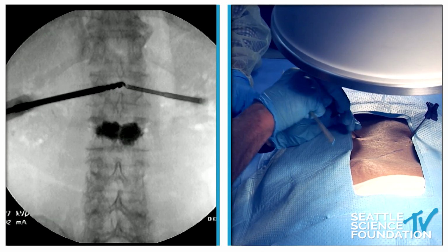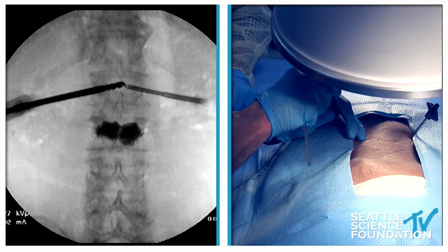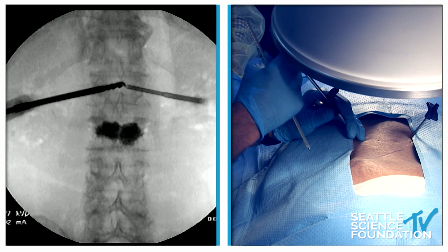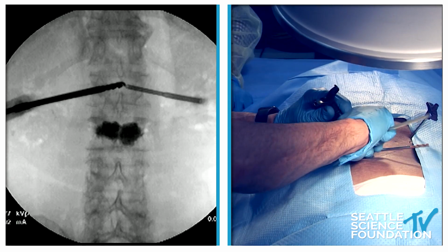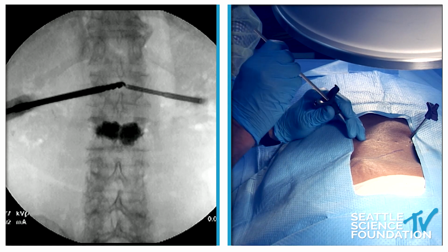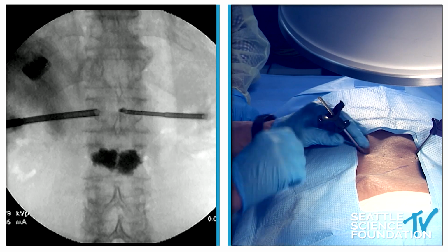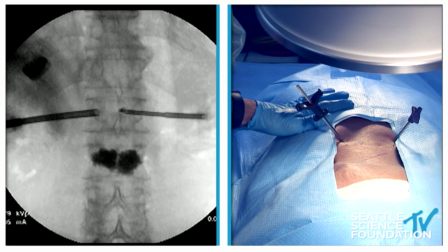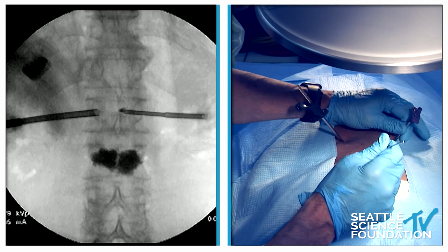And then I'm going to place this acrylic plug after I take the reamer out, leaving the working channel in place. A little bit more, thank you. And the acrylic plug is to stop the bleeding as we go to work on the contralateral side. All right, so we can see the plug and the tip, and I'm going to just go ahead and go back lateral.